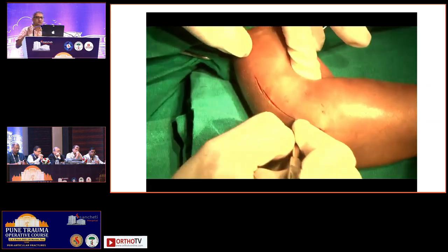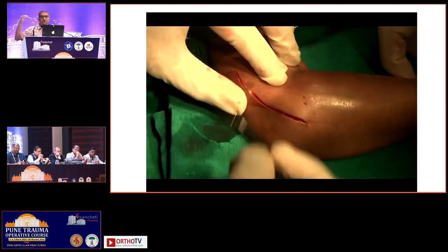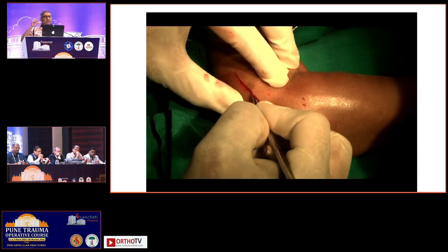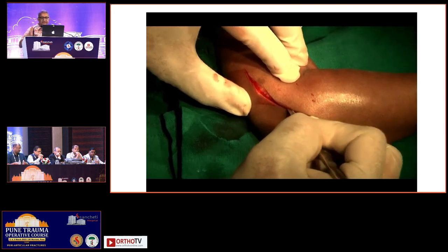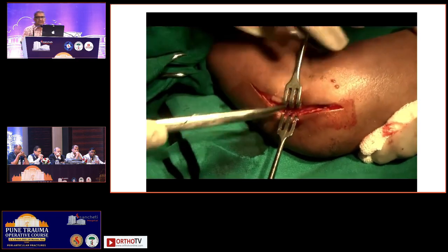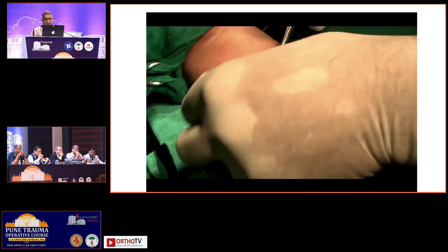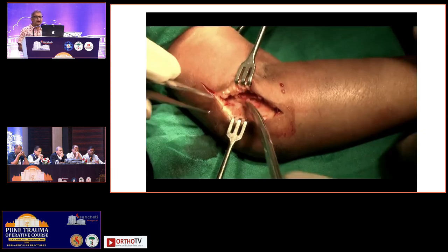The incision has to be fairly long, because you have to go from the lower humerus onto the upper part of the forearm. You cannot do this with a small keyhole incision. So skin, subcutaneous tissue, and the dissection is pretty simple. You will feel the lateral condyle just underneath the subcutaneous tissue. You don't have to dissect much.